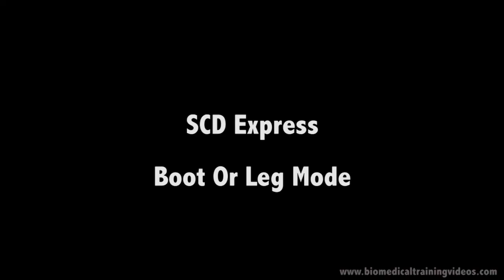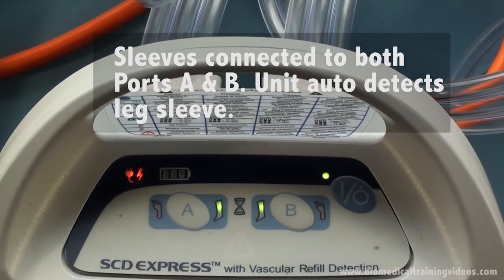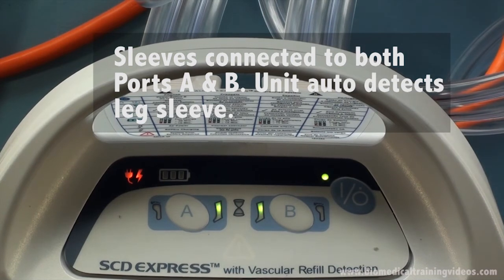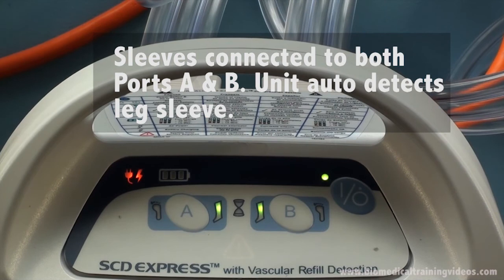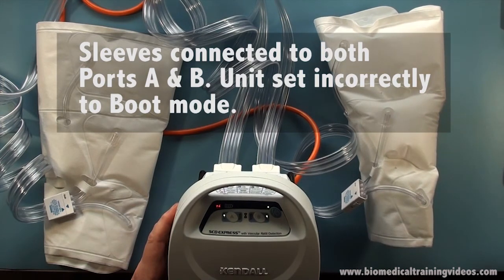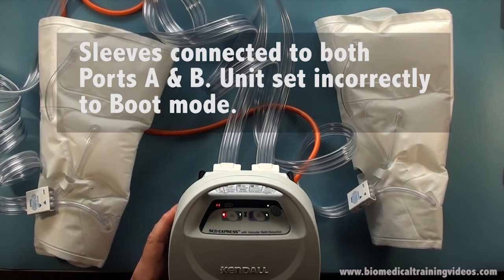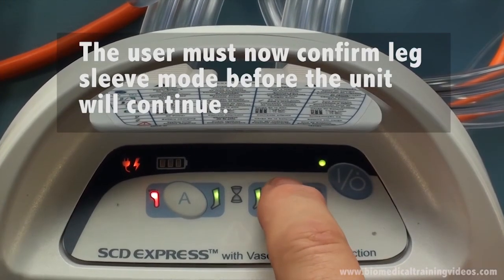Just showing the boot and leg modes and how that works. In this case we have got sleeves connected to both ports A and B, so it will auto detect what sort of sleeves are connected. I have now set the unit to be in boot mode but I have got leg sleeves applied. The unit will flash with a red LED to indicate there's a problem and requires the user to confirm the correct mode before it will go on.